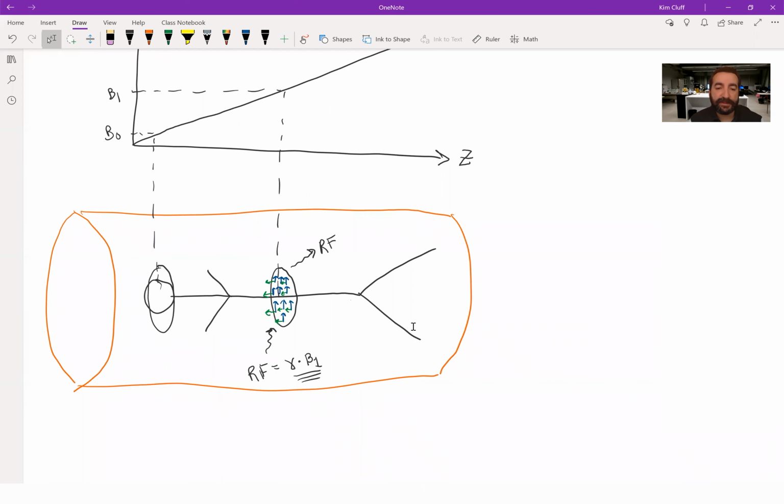So then you can now see, okay, hey, this pixel is water, this pixel is muscle. These group of pixels are muscle, this group of pixels are brain, this group of pixels water, because they have different T1, T2 parameters or relaxation times, and they give contrast.